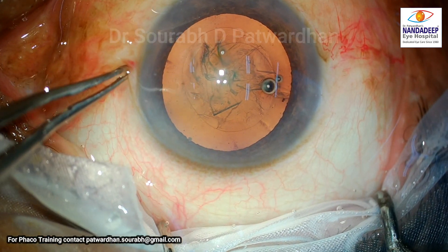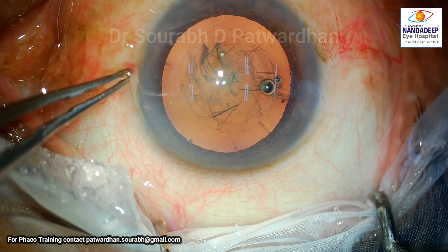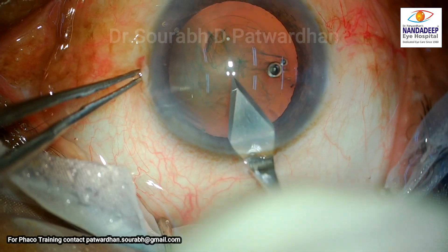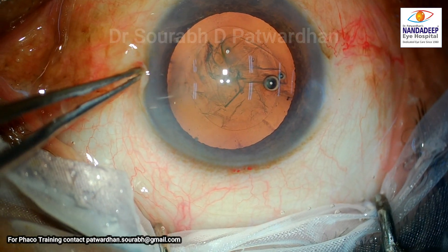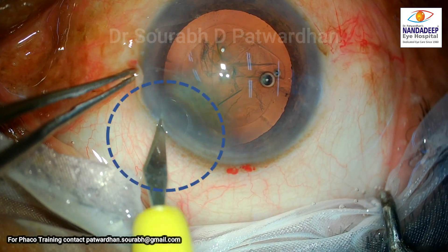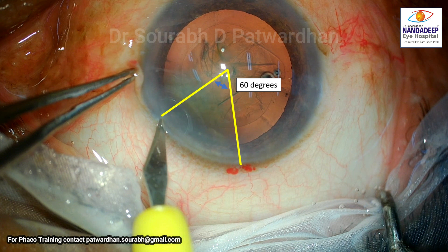The surgeon has done the capsulorrhexis — it looks good. The surgeon has done it through the right side port incision and is now going to make the main incision. I would say it's a bit of a premature entry — I would like a longer incision. The surgeon then uses the dominant right hand to make the left side port incision, which I feel should be avoided, as it doesn't give the right direction to the incision and may lead to an irregular, non-self-sealing incision.